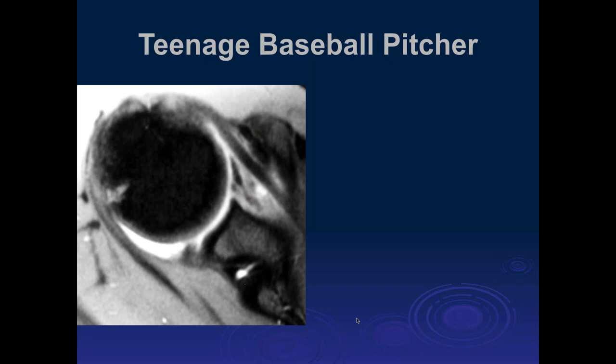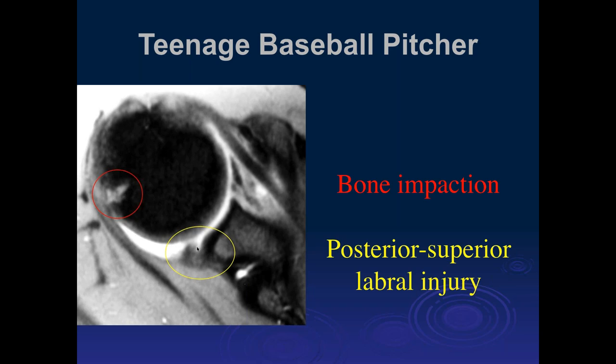Thomas, what do you think of this case — a teenage baseball player? There's some irregularity at the posterior superior humeral head. That could be posterior impingement, but you also need some of the other components, because this alone could just be a traction injury. But we can also see a posterior superior labral tear.